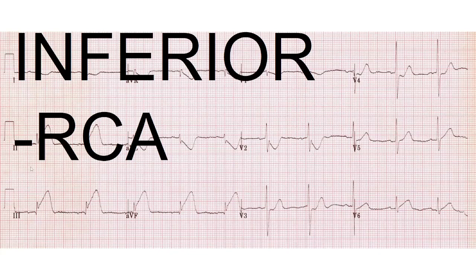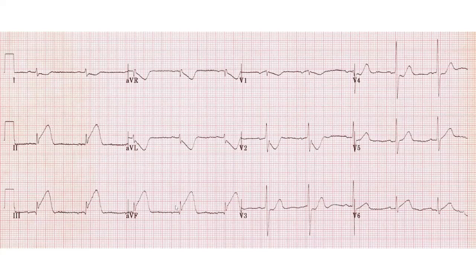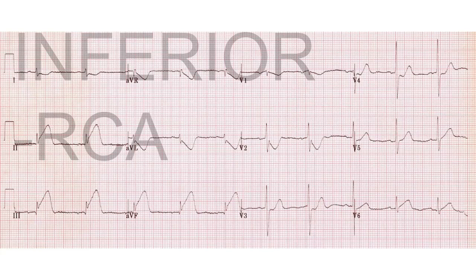Another inferior STEMI — usually a blockage of the right coronary artery. Leads two, three, and AVF show an incredible amount of ST segment elevation. Lead one and AVL have the reciprocal depression we want to see, and in V2 and a little in V1 there's ST segment depression indicating posterior involvement as well. The RCA perfuses the entirety of the conduction system, so we need to anticipate heart blocks and bradycardia. Have pads on the patient, atropine ready, pressor agents available, be very careful with nitrate therapy, establish large bore IV access, and be ready to increase preload.